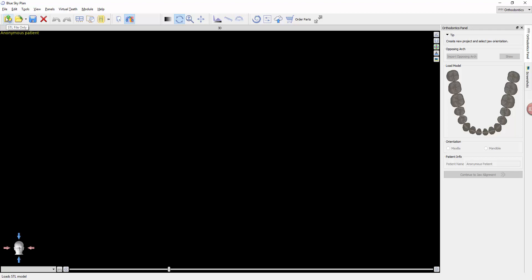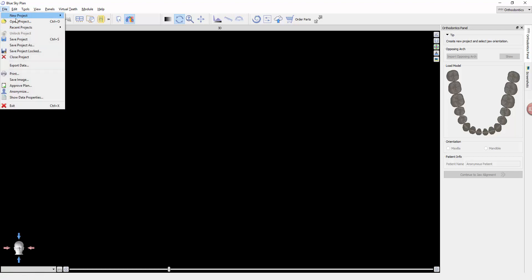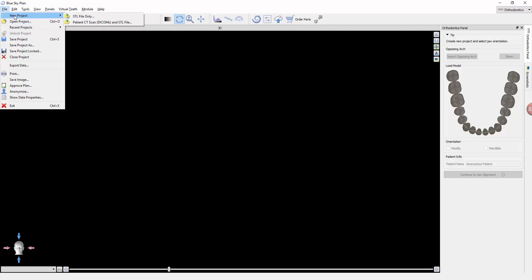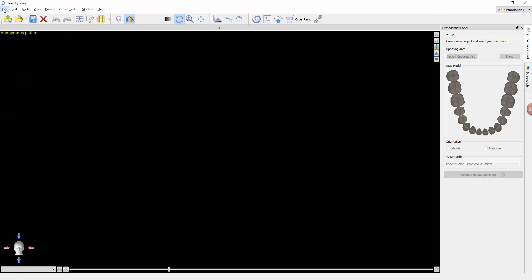One of the things that stumbles people up a little bit is open project and new project. Just keep in mind, unless you've already worked up and saved a project, you won't have a case to open. You're looking for a new project. We're just going to be going over a single STL file case, as opposed to integrating with DICOM. That's more of an advanced feature, but just want to know that it is there.